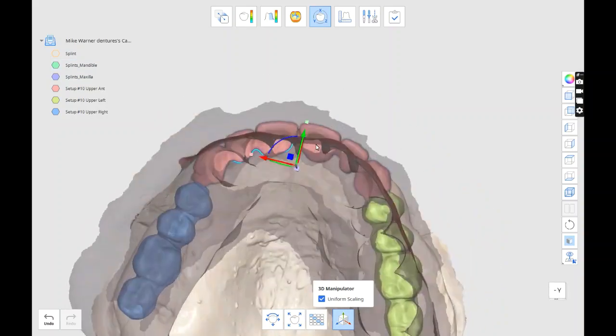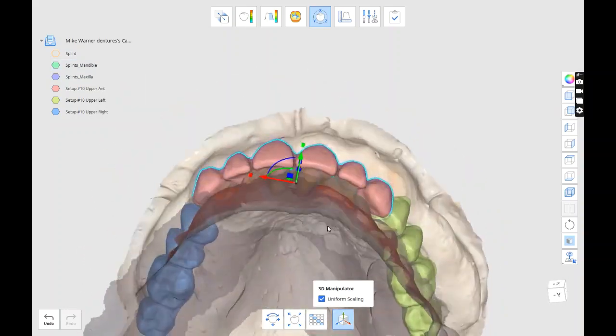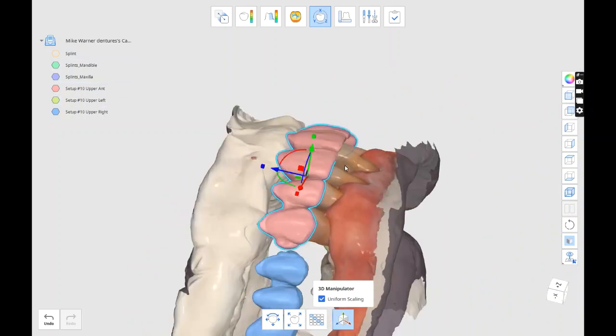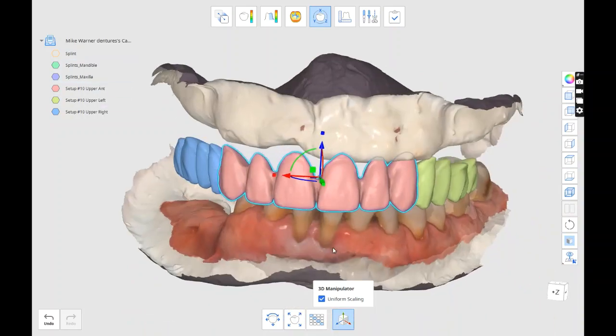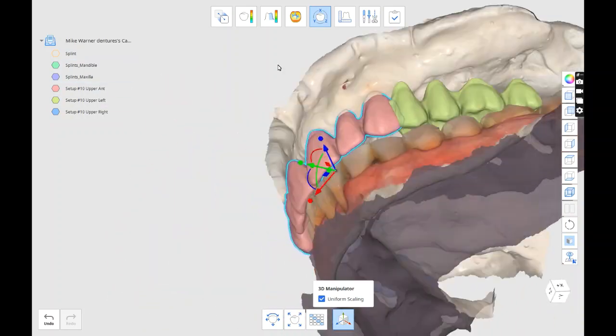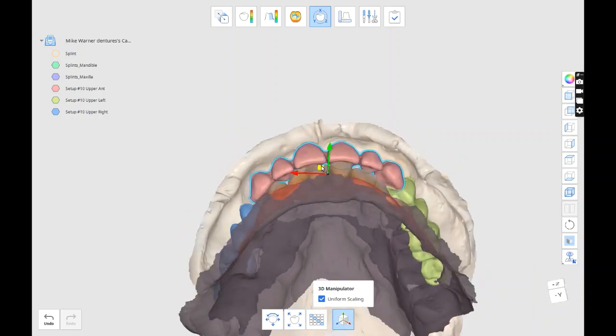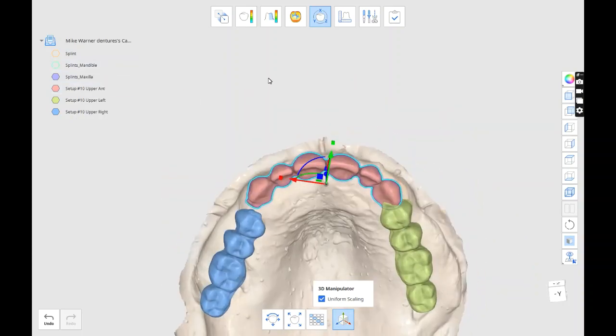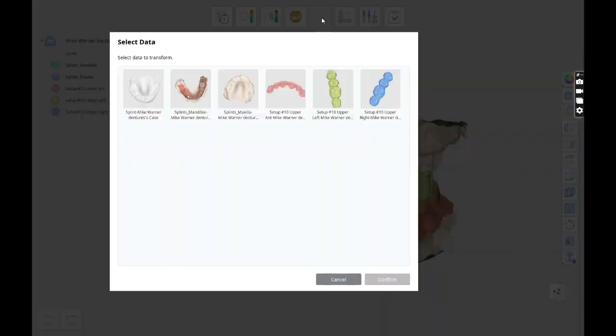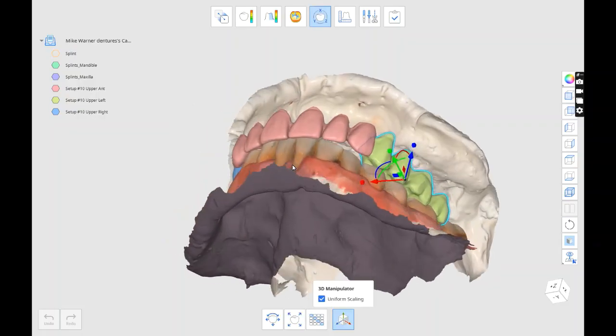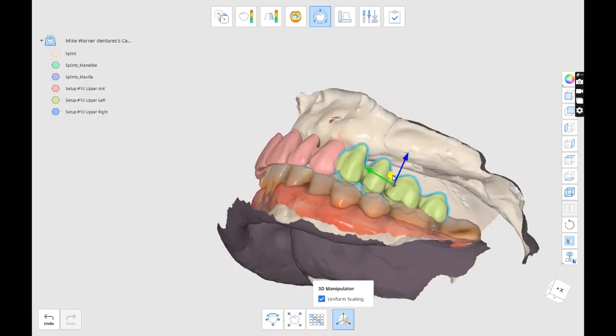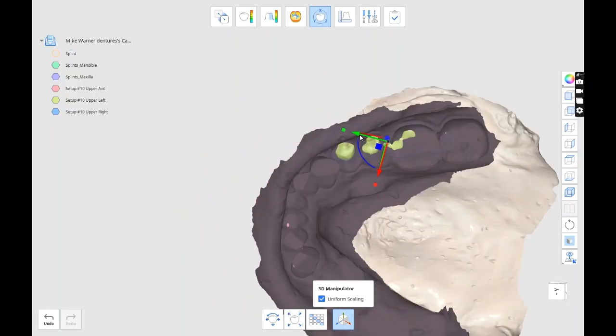I've got - you can import it as a whole or in segments. Here I did it in segments, knowing that I'll probably have to adjust the posterior teeth to get occlusion. So anyway, this is how you do it - bring in the teeth, adjust the teeth segments accordingly. I get them close.